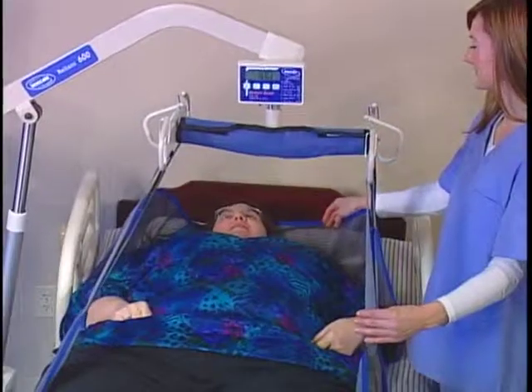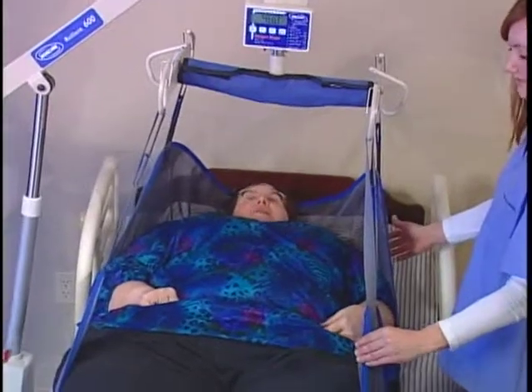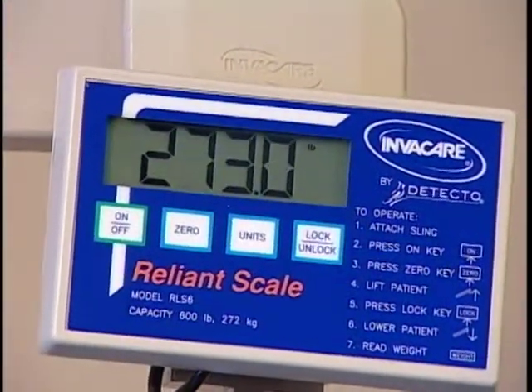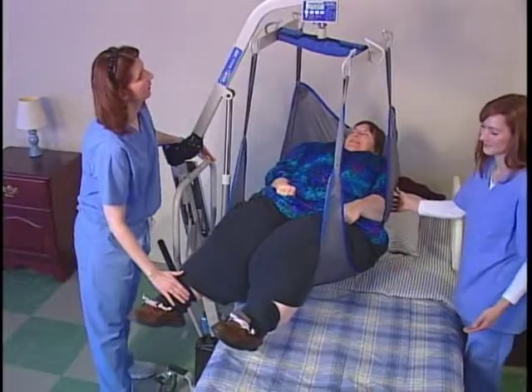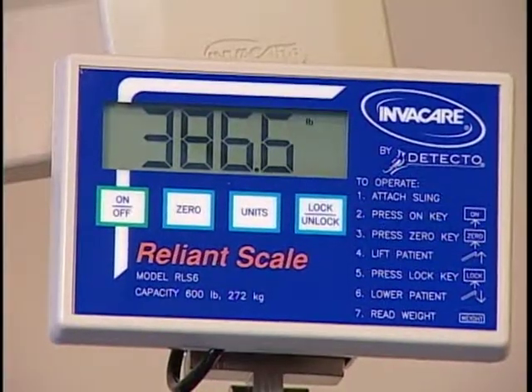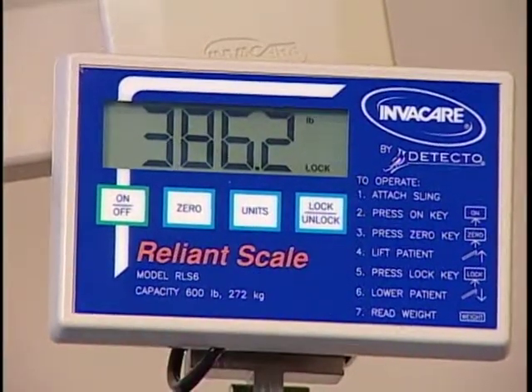Place the resident in the sling and raise them so that their weight is fully supported by the lift. The scale accurately measures the weight. It's normal for the reading to fluctuate for a while during this process. When this fluctuation decreases to a rate of about two-tenths of a pound, press the LOCK-UNLOCK key to lock the weight display.